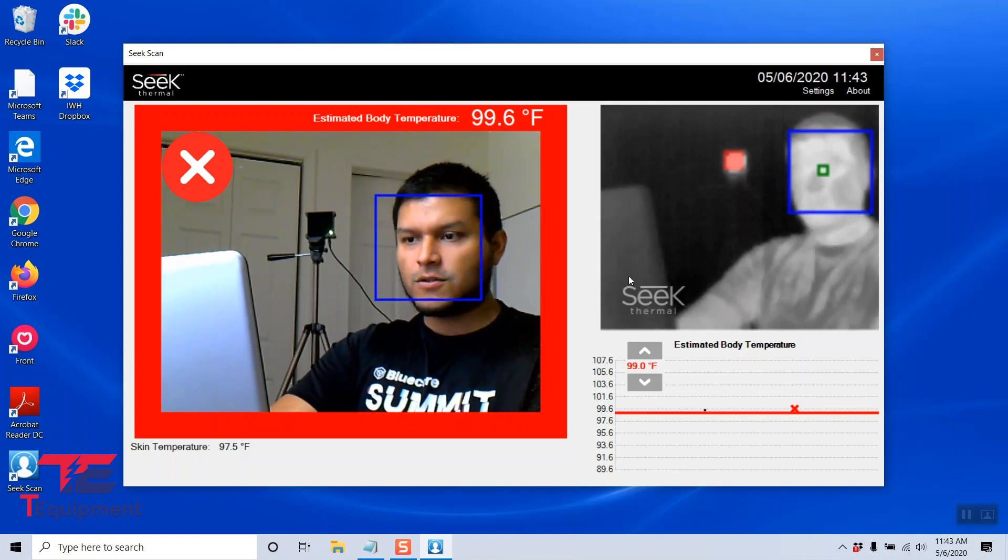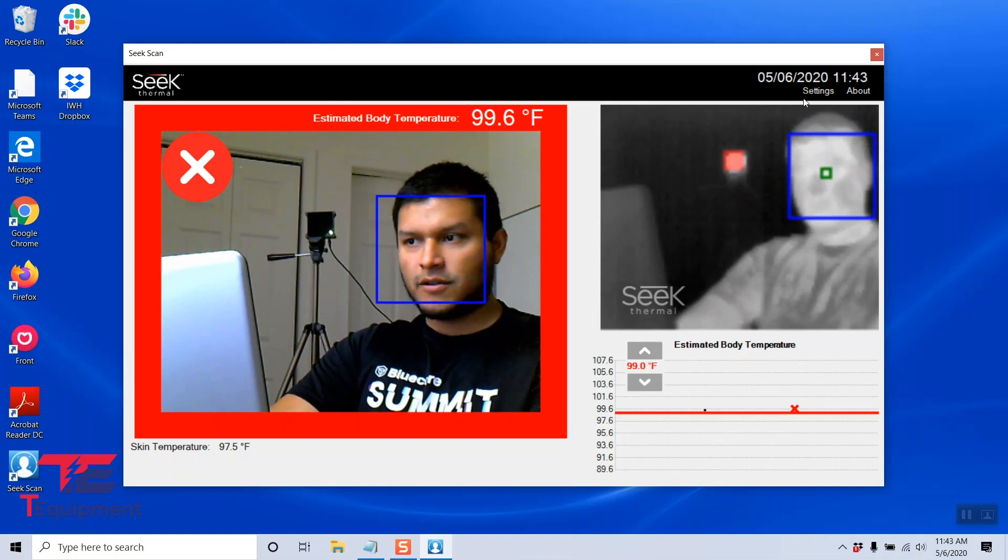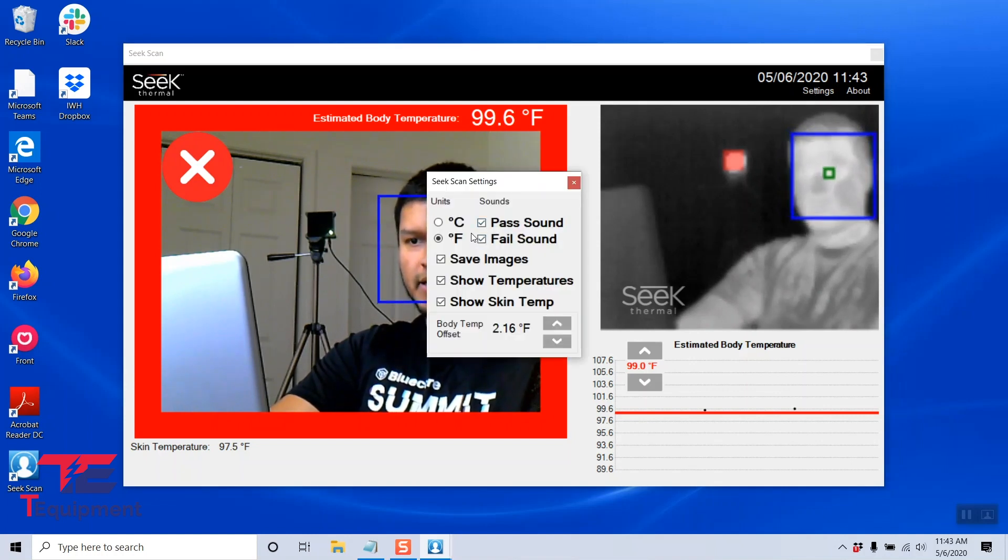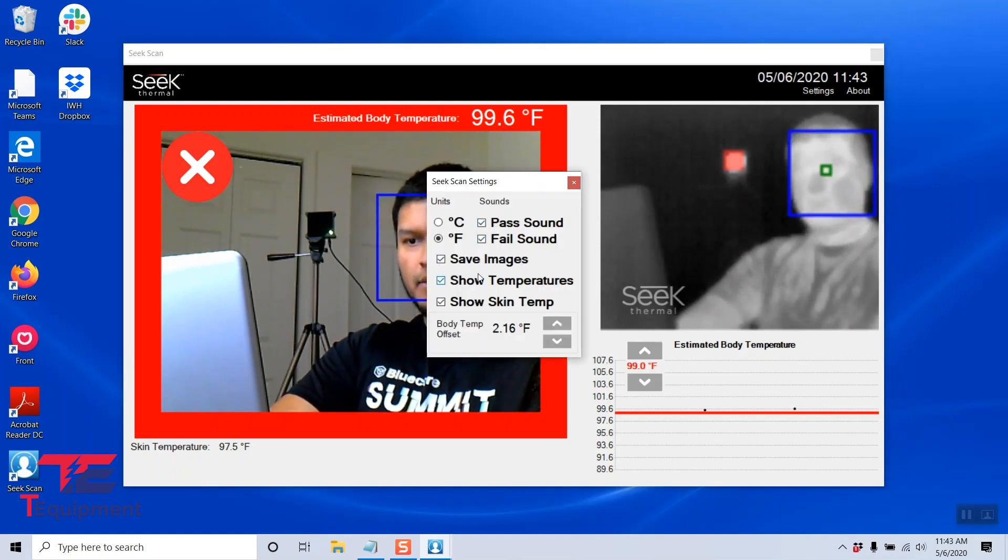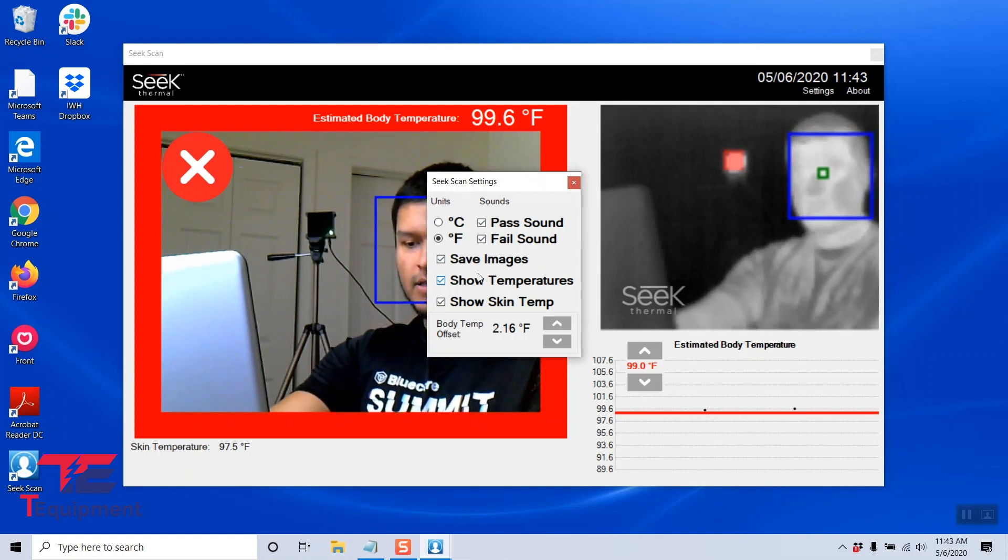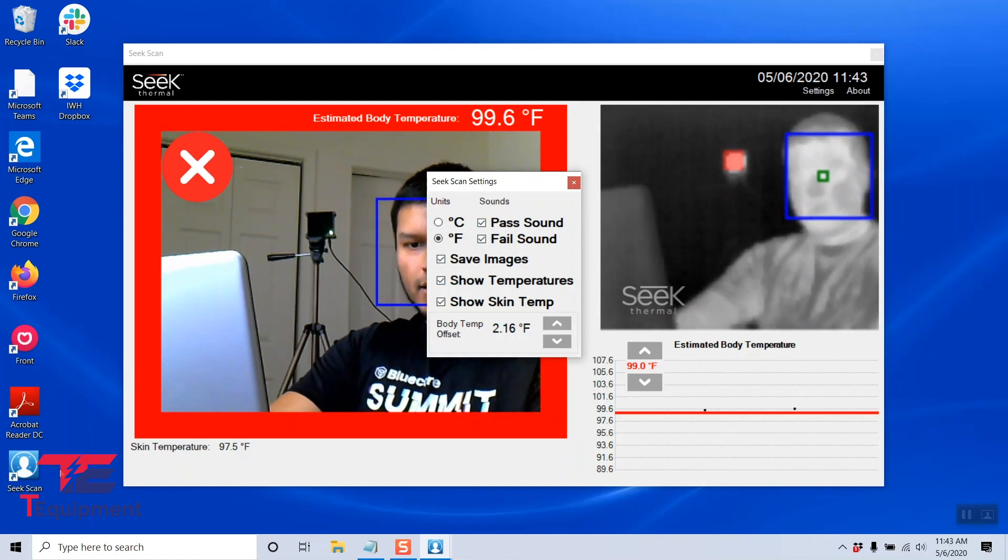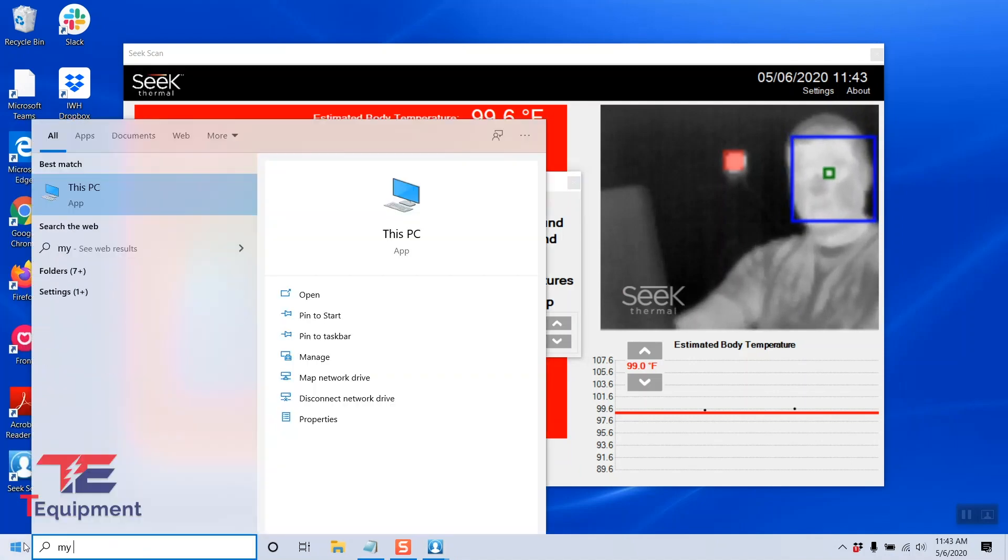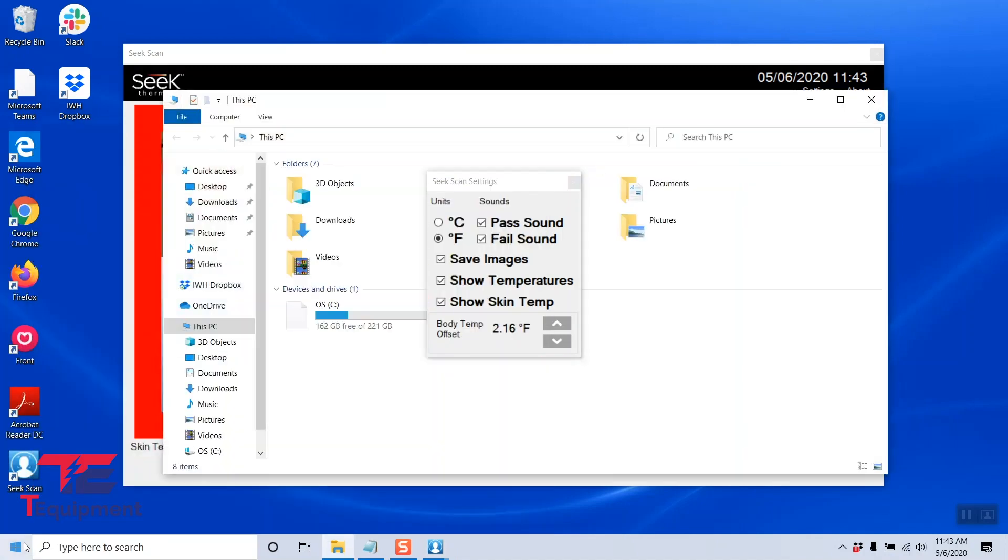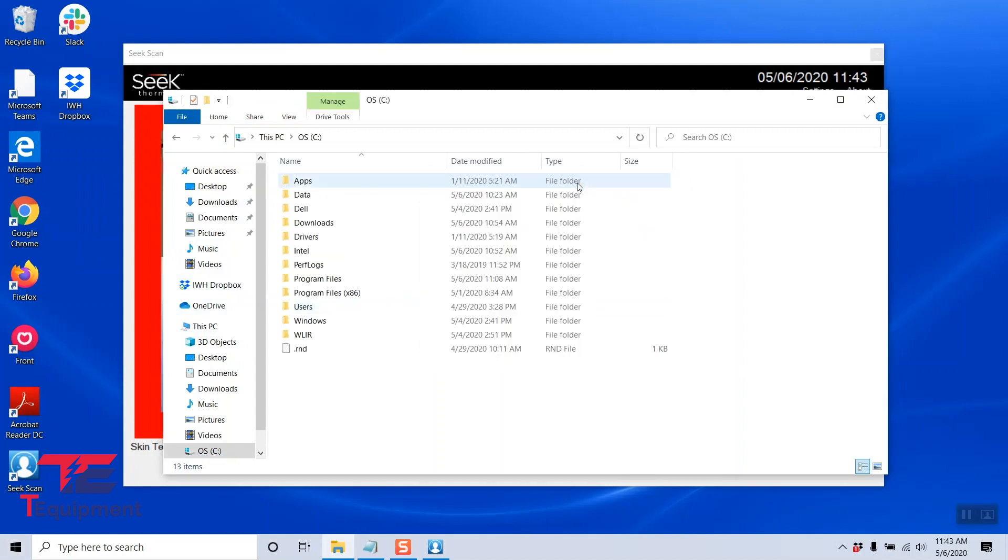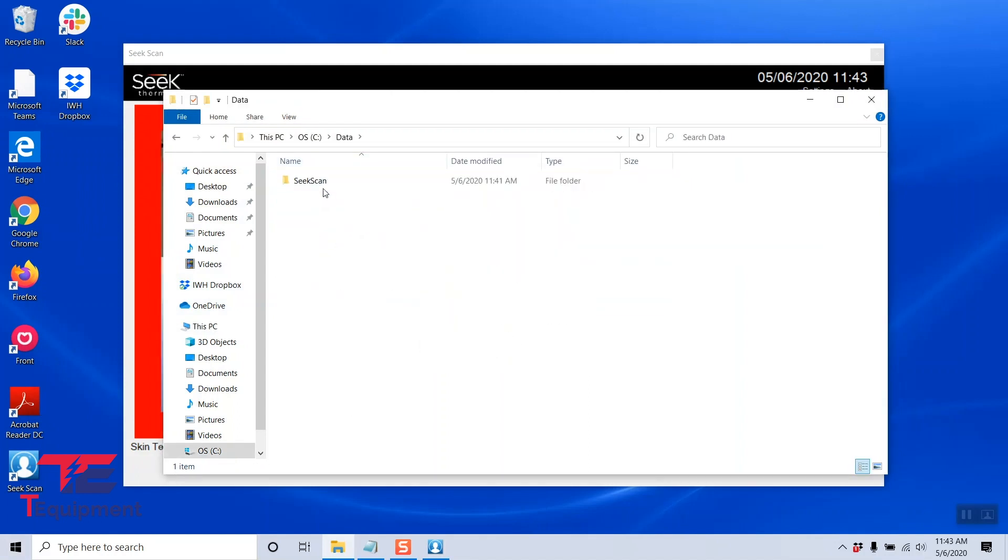And we can also look into the other setting we applied. Again, from the top right settings, we wanted it to save images. So images are saved in C, and we can open this here. I'm going to go ahead and type my PC, go to my C drive here, close the temperatures, and go to data, seek scan.